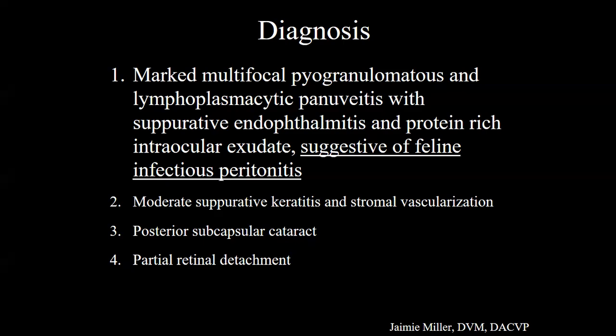You'd think in this case that the testing would be reasonably rewarding. It seems like with more macrophages, you'd be more likely to get a positive result. Yes, the IHC targets the macrophages, and with a lot of macrophages, especially a lot of them kind of free in the chambers, that's where we've had our most success with getting good positive results. So this would be a good one if they were interested in sending it off.